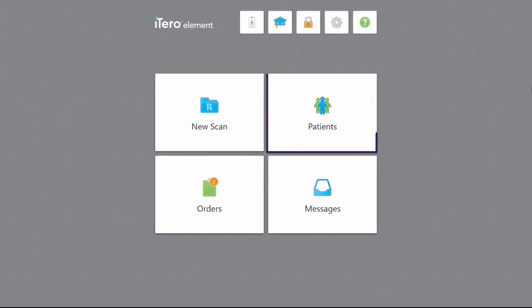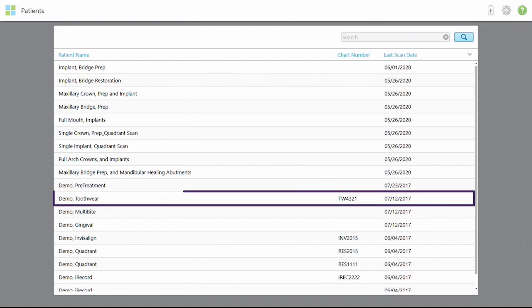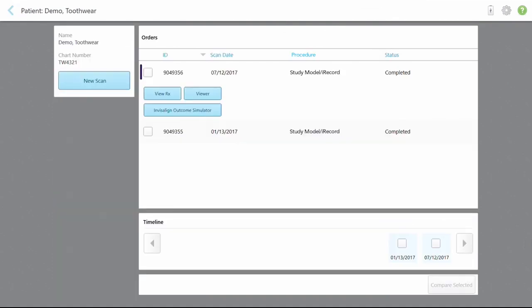Check that the scanner is online and from the home screen tap the patient's icon. Select the patient name from the list. Next, select two scan dates to be compared. Note that you can only compare two scans at a time.